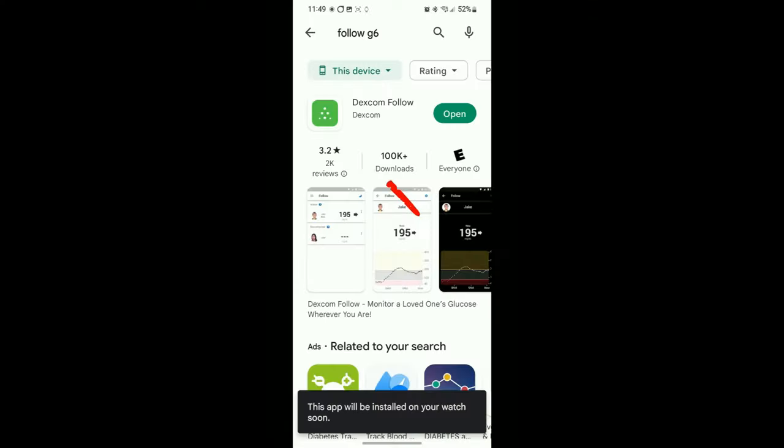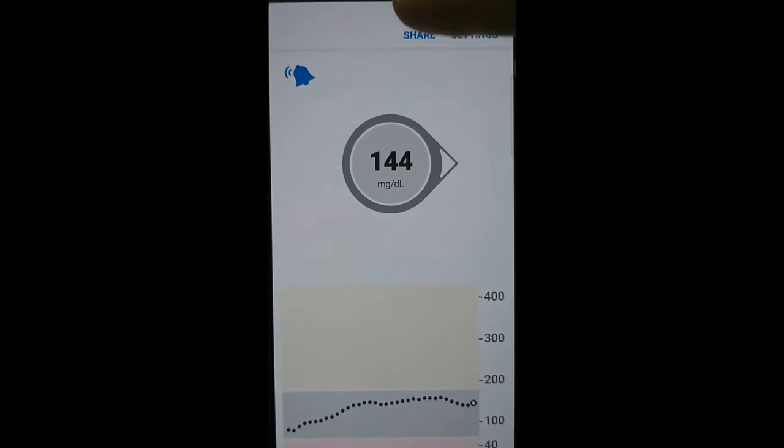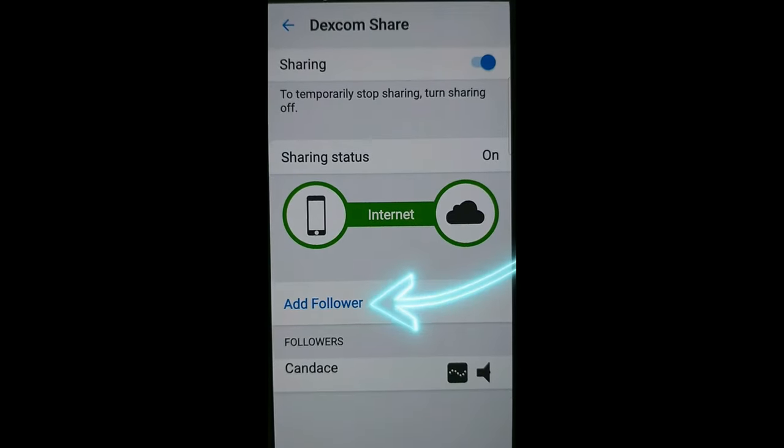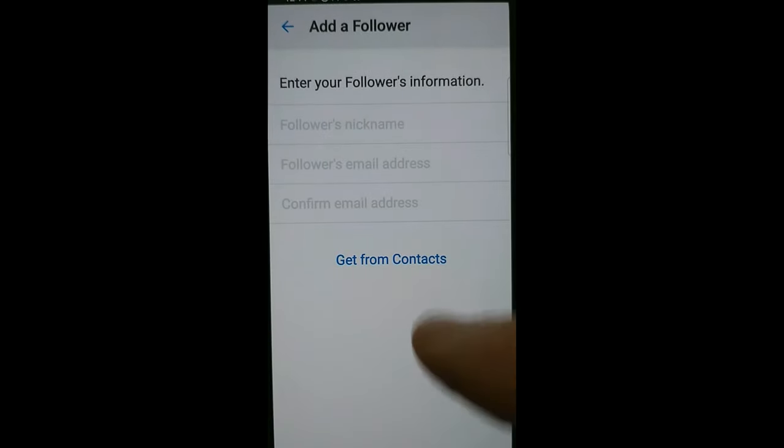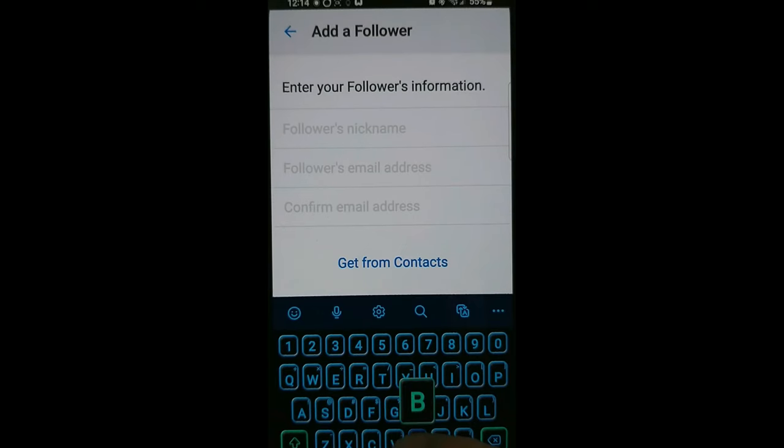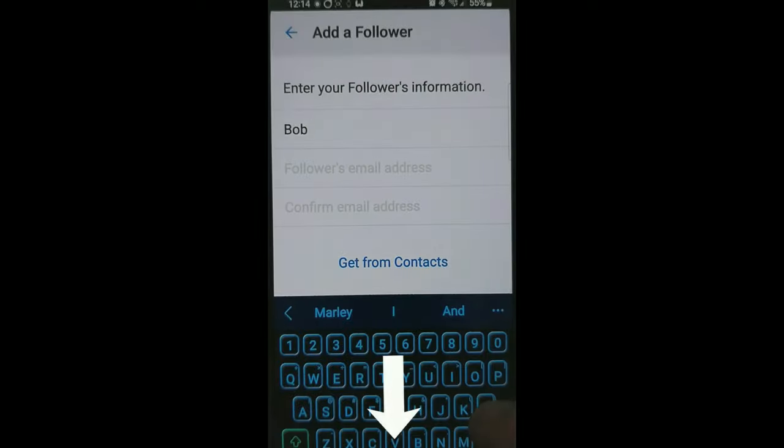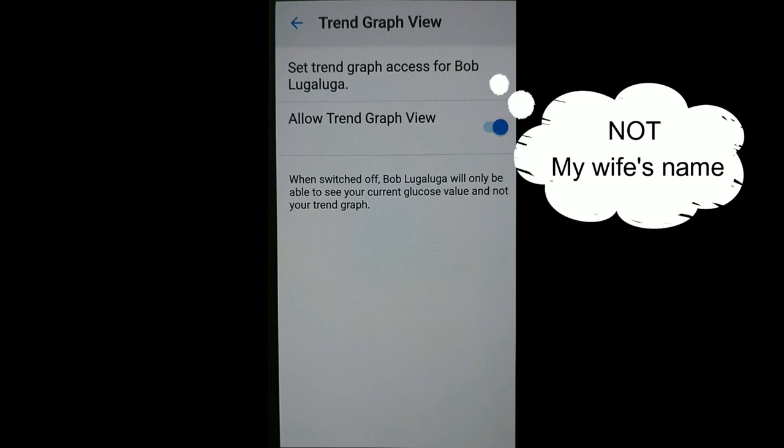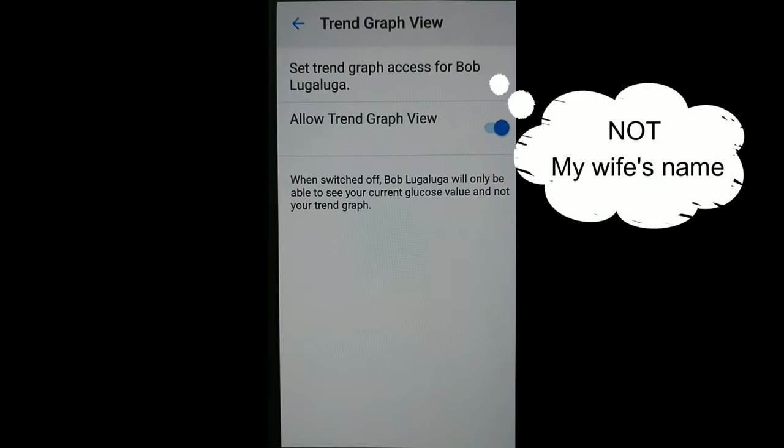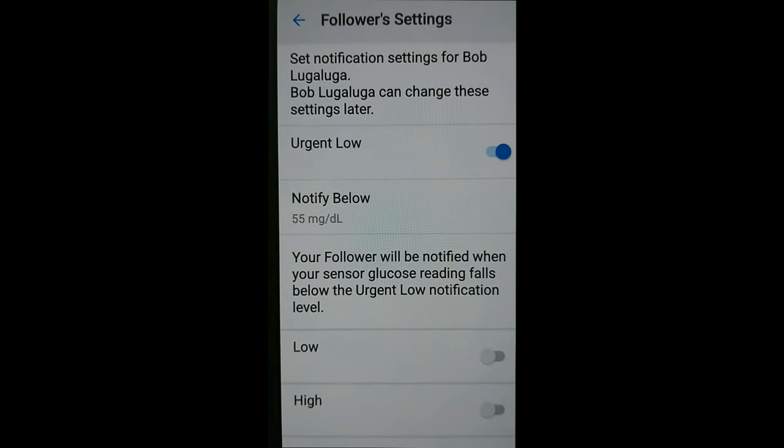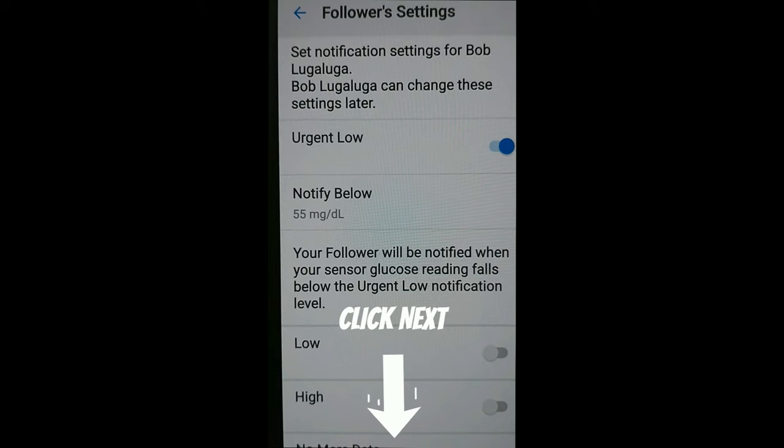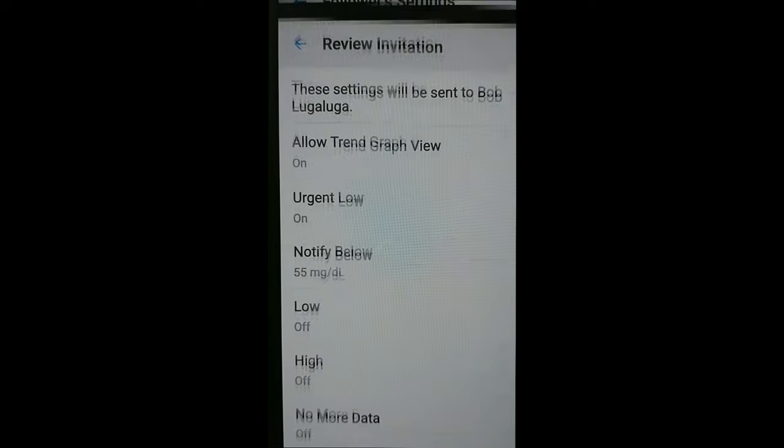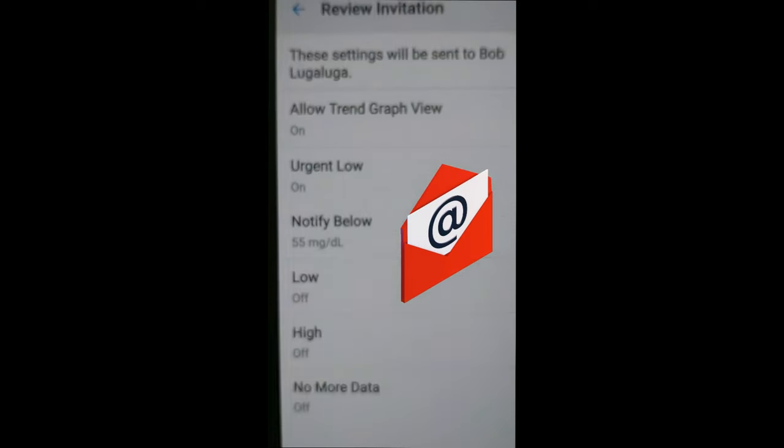Okay, first you want to set up your Dexcom Follow app. You can find that in your Android store. Go to your Dexcom G6 app and hit the share button and add yourself a follower. I added my wife because I have access to her email. You're going to need that. Put in the information and click next. Trend graph view, set that up how you want and click next. Follower settings, whatever you want them to see and click next. Then review the information. After you're done with this step, it's going to send an email to your family member.